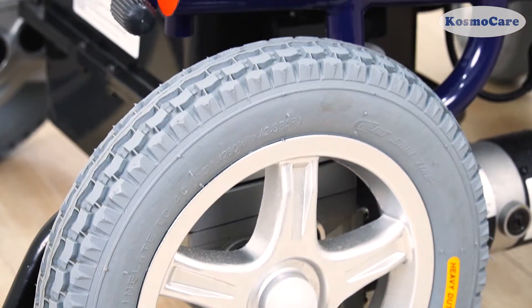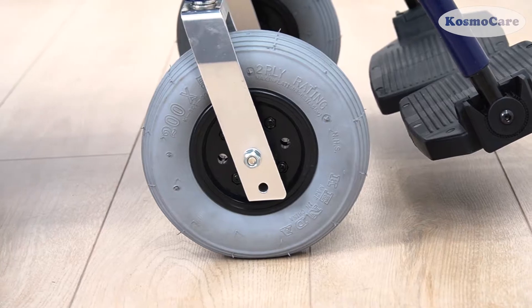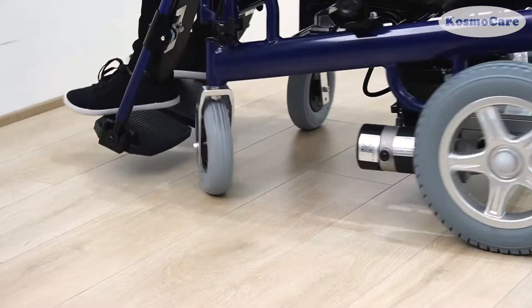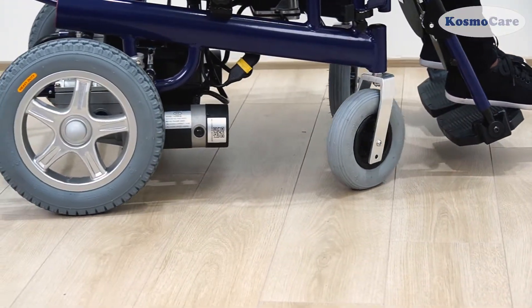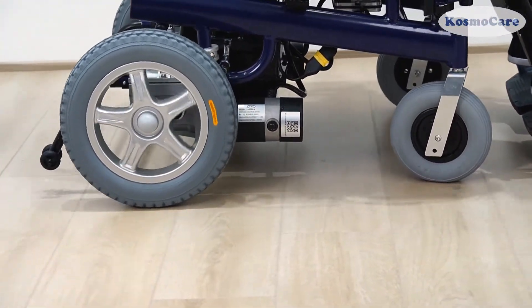The large rear wheels and heavy duty front casters are extremely durable and help you smoothly navigate over any terrain, including grass, pavement, gravel, etc.